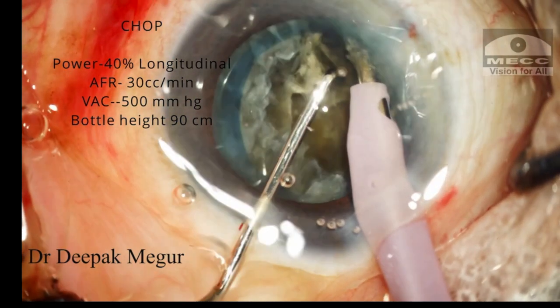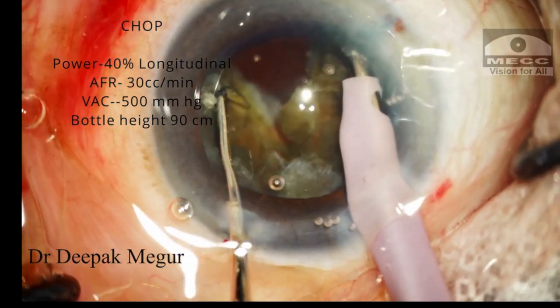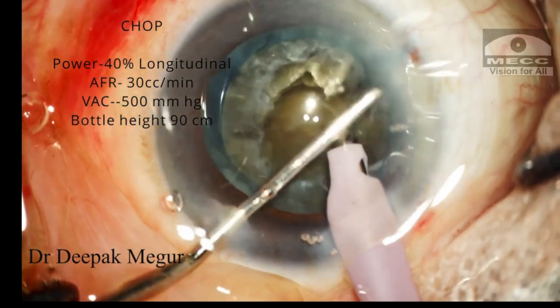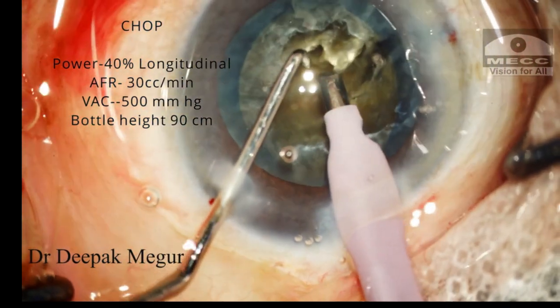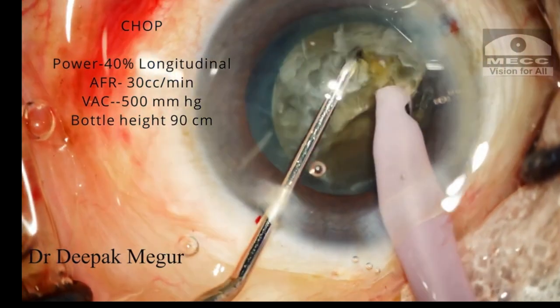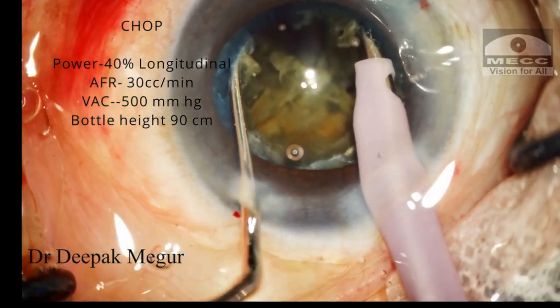The lateral separation maneuvers will be repeated at progressively deeper planes, as this is a denser cataract. Once the posterior plate is cracked, I move on to create the next chop. Again, similar maneuvers: bury, vertical chop, and then lateral separation.